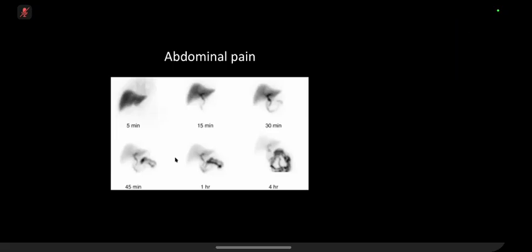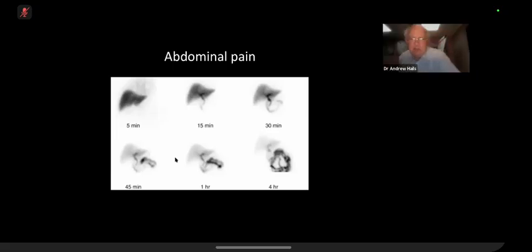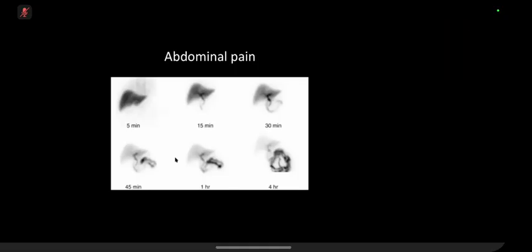The gallbladder? Yeah. Now, assuming the patient hasn't had a cholecystectomy, which of course is sometimes a big assumption in the hospital, isn't it? But why have they got abdominal pain? They had some other form of abdominal surgery, maybe a resection, and everything's plumbed in abnormally.